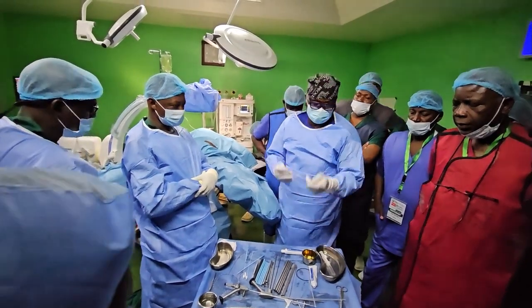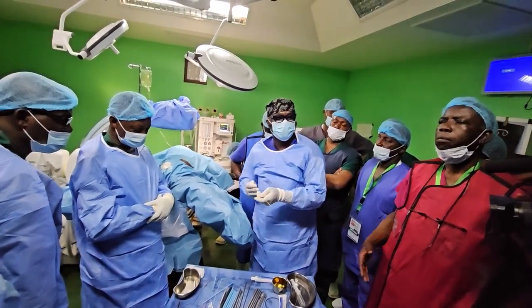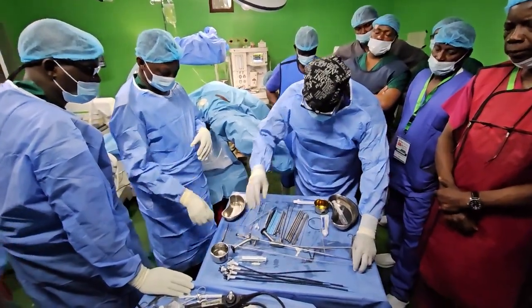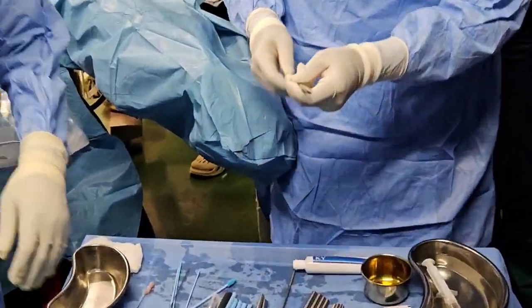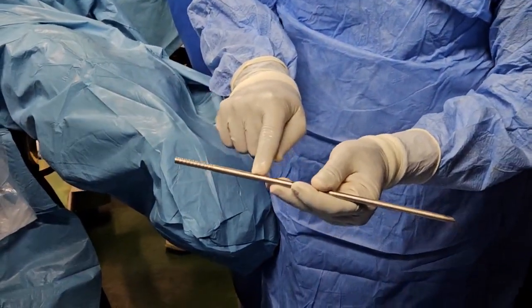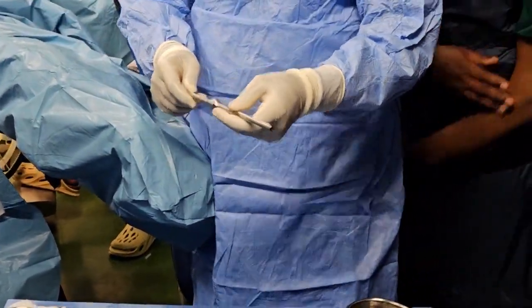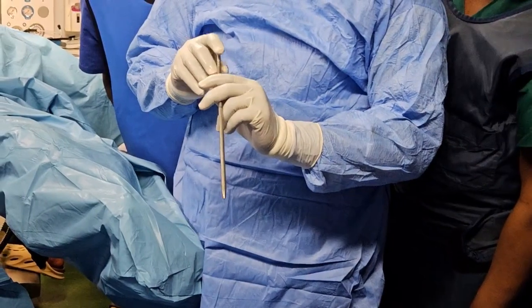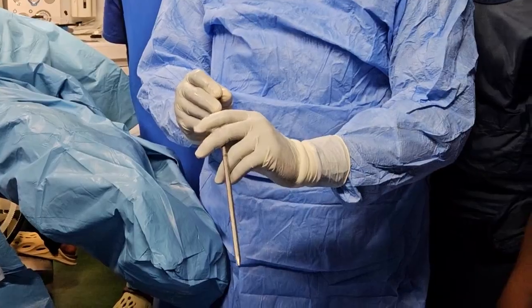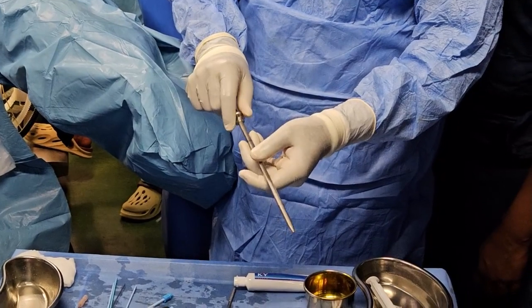That is telescopic dilatation. Then there's what we call single-step dilatation, since people are moving towards it nowadays. We are privileged that Castor has that. For instance, if I'm doing 21, 22 French, which has its own metallic Amplatz, in a single step, under fluoroscopic guidance, I get into where I'm going. You get to where you are going, and then you can gently move this over it.